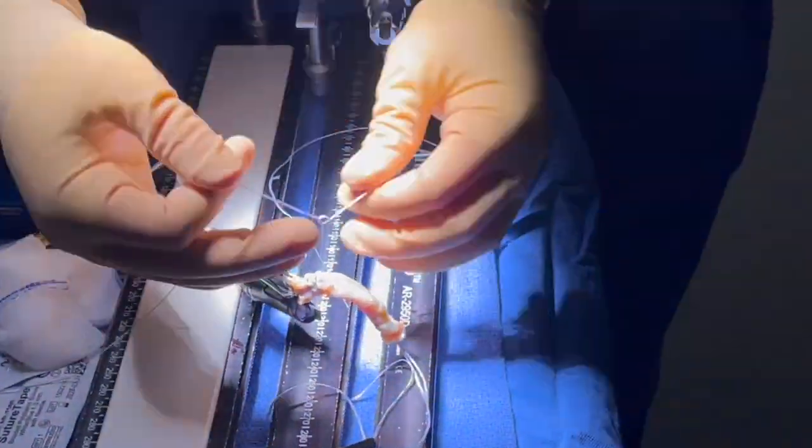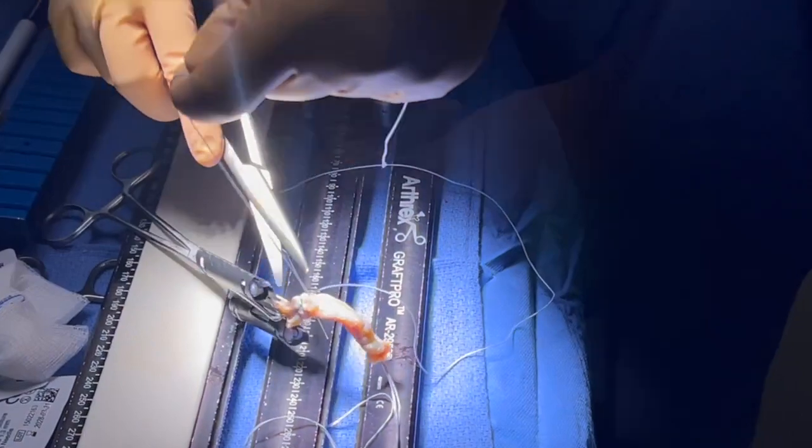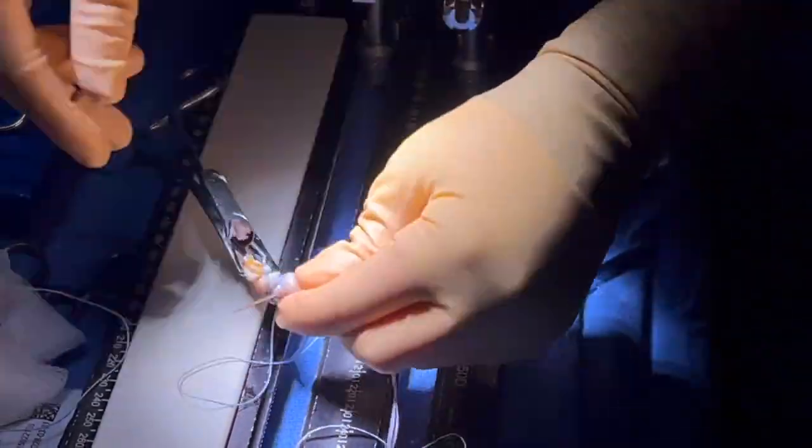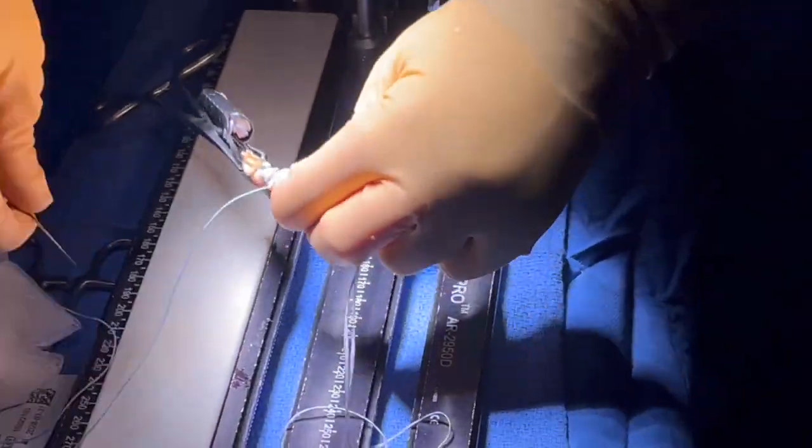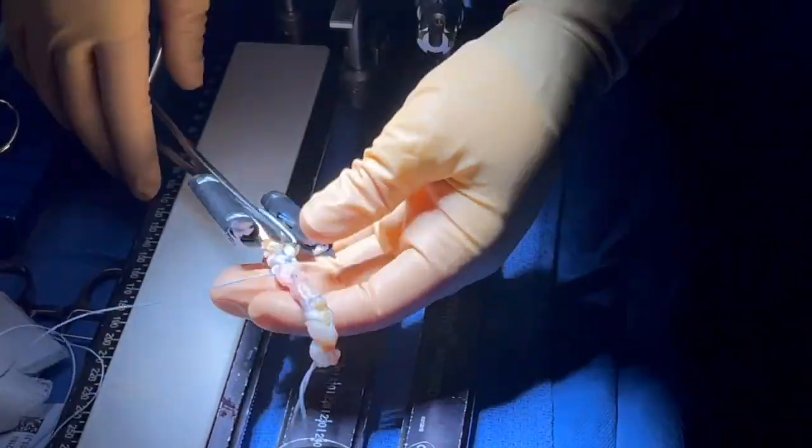Alternating half hitches are needed at the end to tie off the device. And then you take one of the limbs off and you pass the other one through the quad. This buries the knot well.